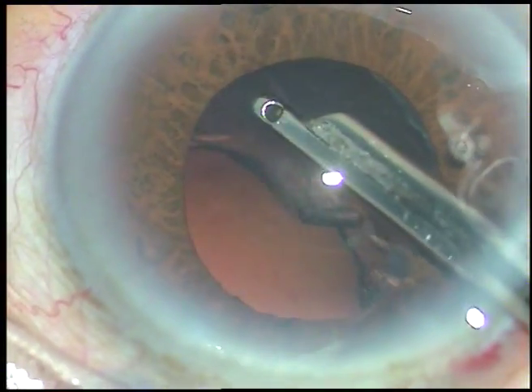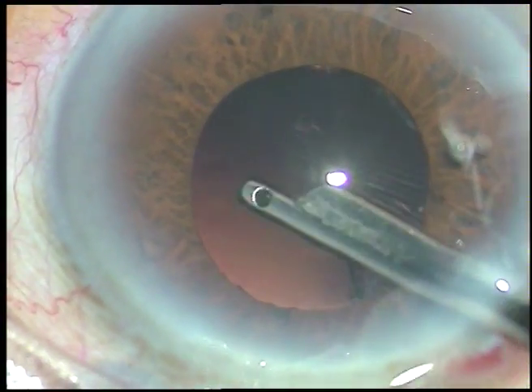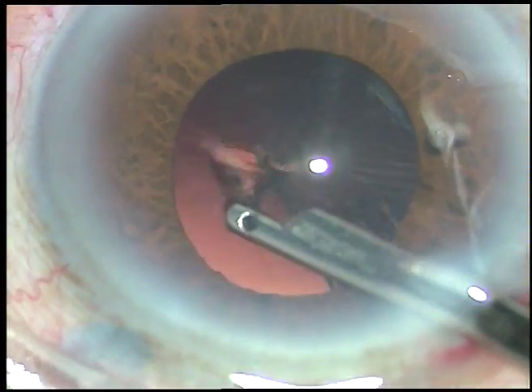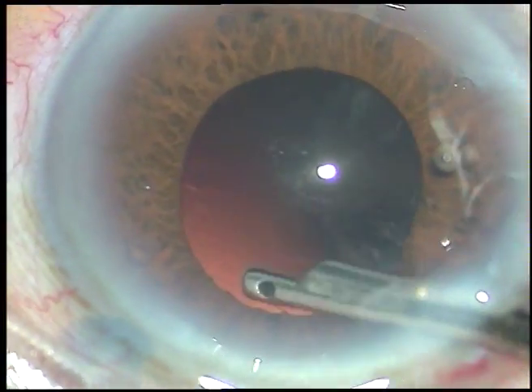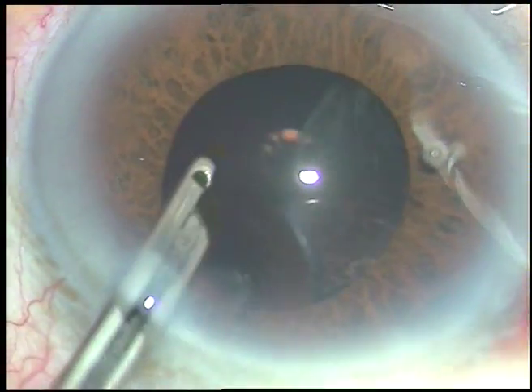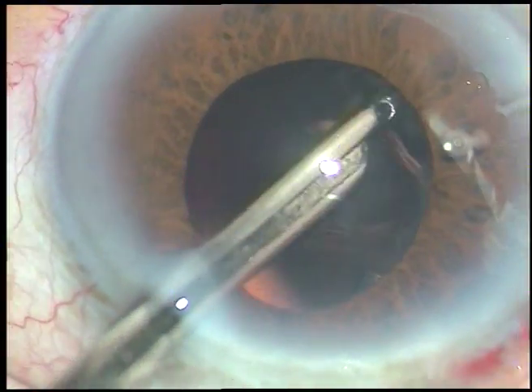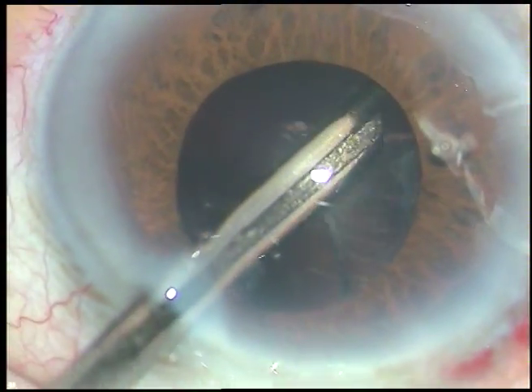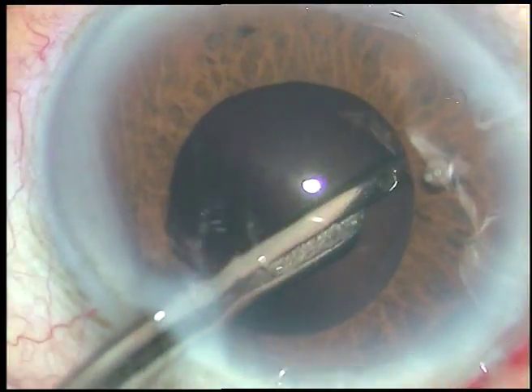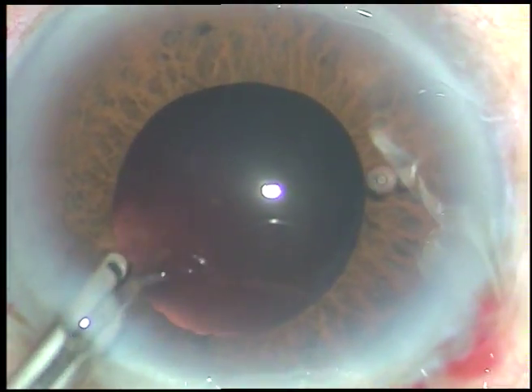I start aspirating from just in front of the main incision, go towards the left side, and in a clockwise manner come to this side — almost more than half done. Now I go through the side port and start anti-clockwise from 10 o'clock, going to 9 o'clock. And that's it — the cortex has been removed.